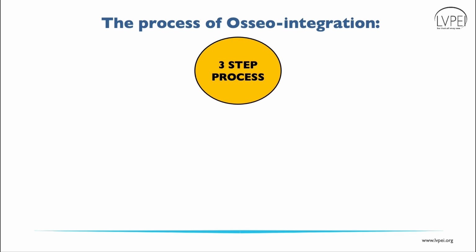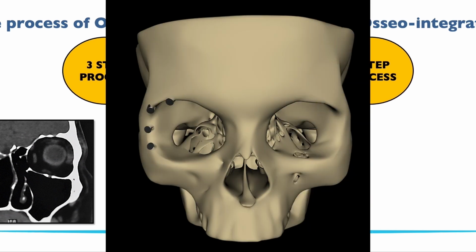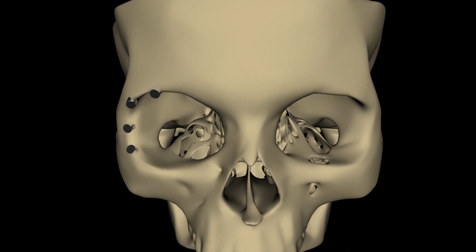First, it's important to choose the correct size of implant which can sit into the orbital rim. The most commonly chosen are the supralateral and the lateral part of the orbital rim, as there is a good cortical thickness of bone here. A pre-operative CT orbit helps to determine the dimensions and decide on the position of implants. 2 adjacent implants should be at least 1 centimeter away from each other.